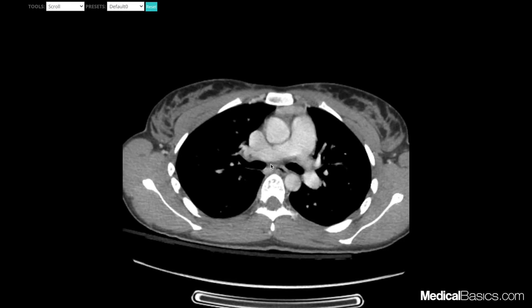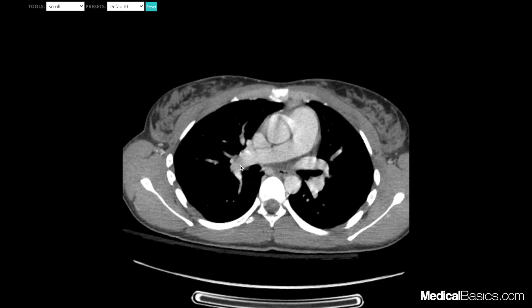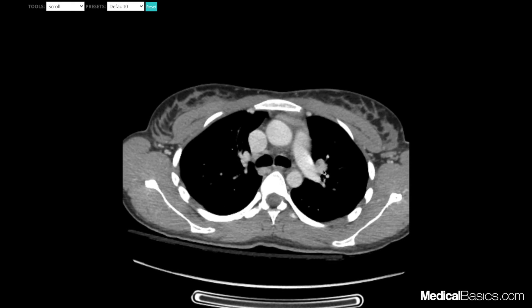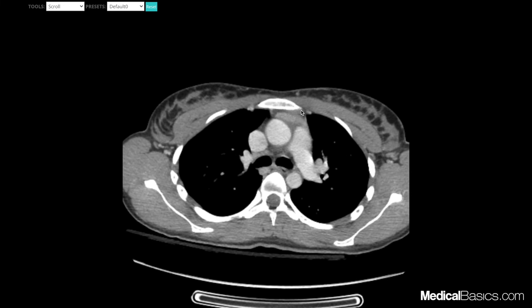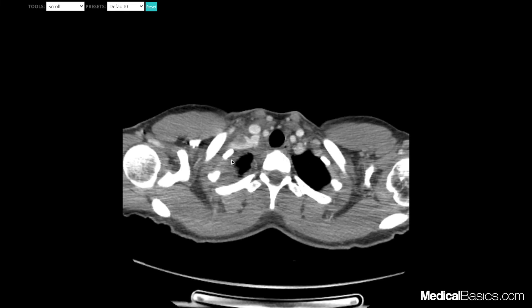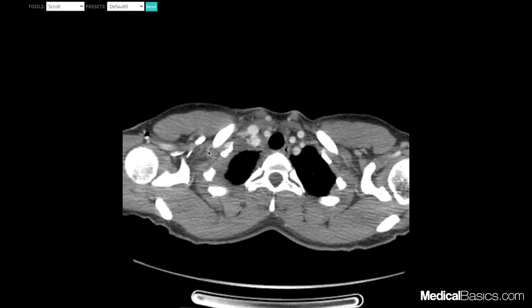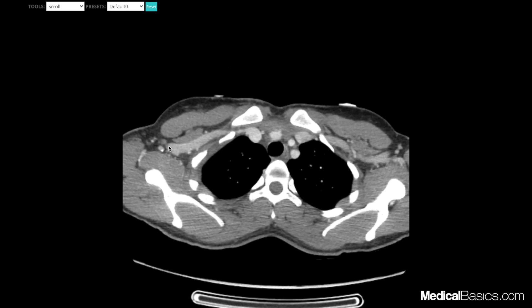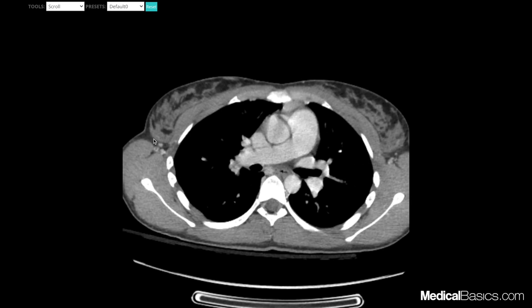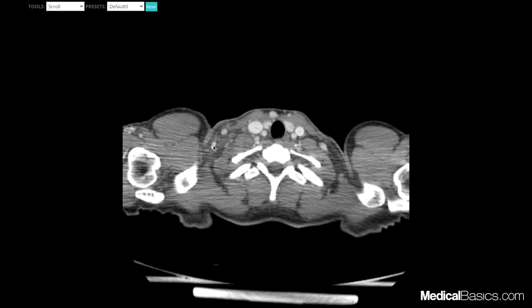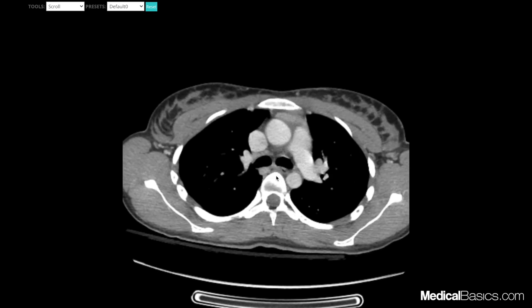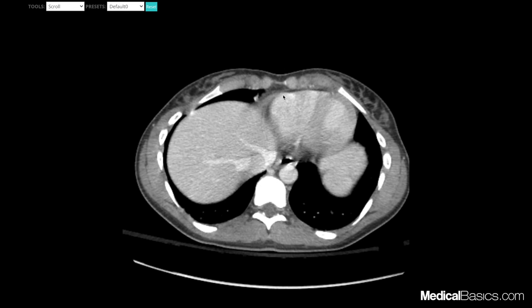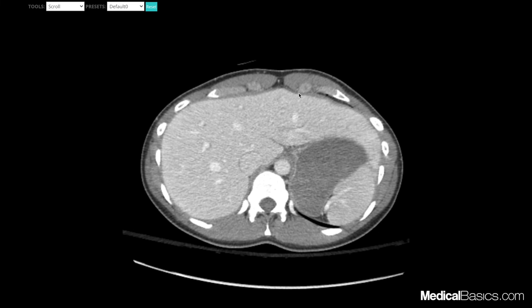Here we'll have our subcarinal lymph nodes, and all of these structures here are going to be our hilar lymph nodes — I'm pointing to vessels, but lymph nodes would appear here if there were lymphadenopathy. Here is where our internal mammary lymph nodes would be. Also common in cancer patients are supraclavicular lymph nodes, which pop up right above the clavicle. Here are our axillary lymph nodes going up and down the axilla on both sides. There are also many cervical lymph nodes, which we'll cover in another video. Here will be our prevertebral and our paravertebral lymph nodes. One thing we shouldn't forget is our cardiophrenic lymph nodes, which typically lie in this space right here.